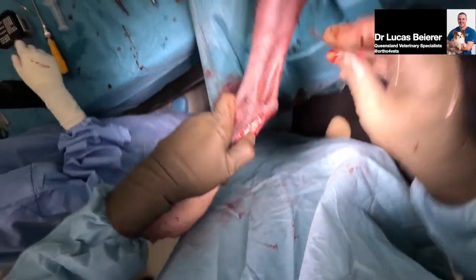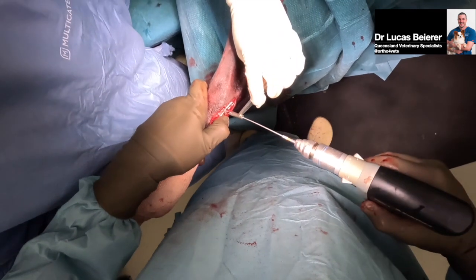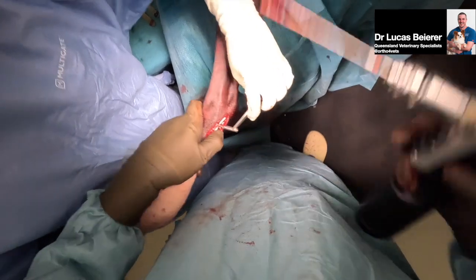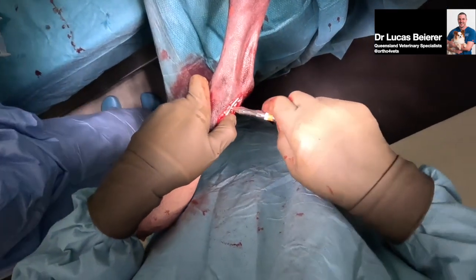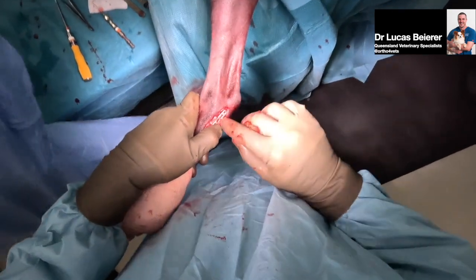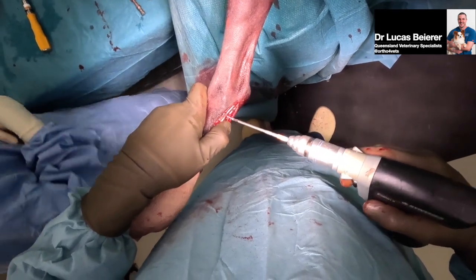We might put a cortical here as well, get the guide. Can you put the guide in there? And push down for neutral and drop your hand towards the floor. Bit more towards the floor. I don't know where that went, to be honest, but it's in something solid. Go a 20, 26. And then we'll get 3-0 monocryl to close, please. Yeah, we'll need another one.